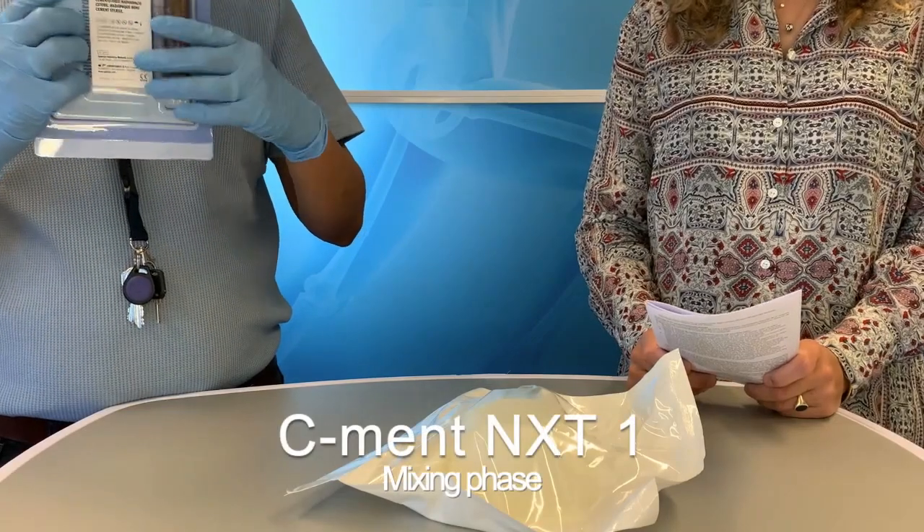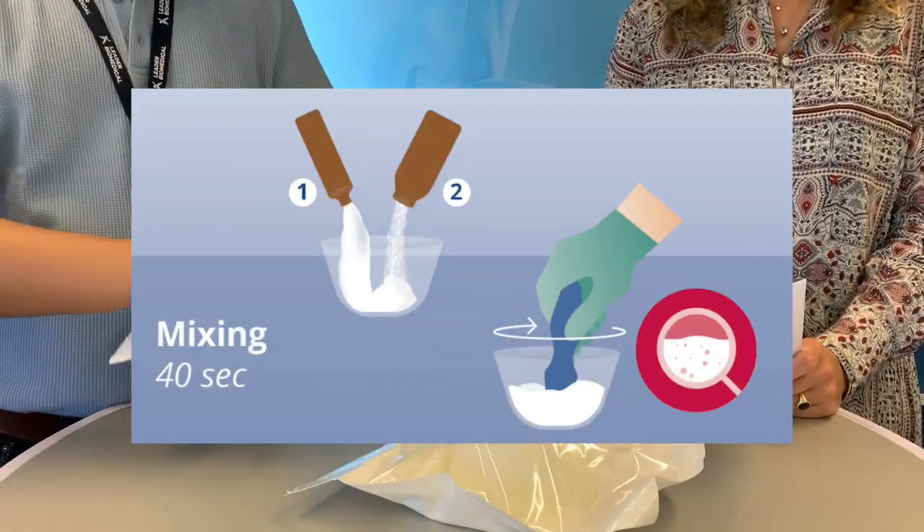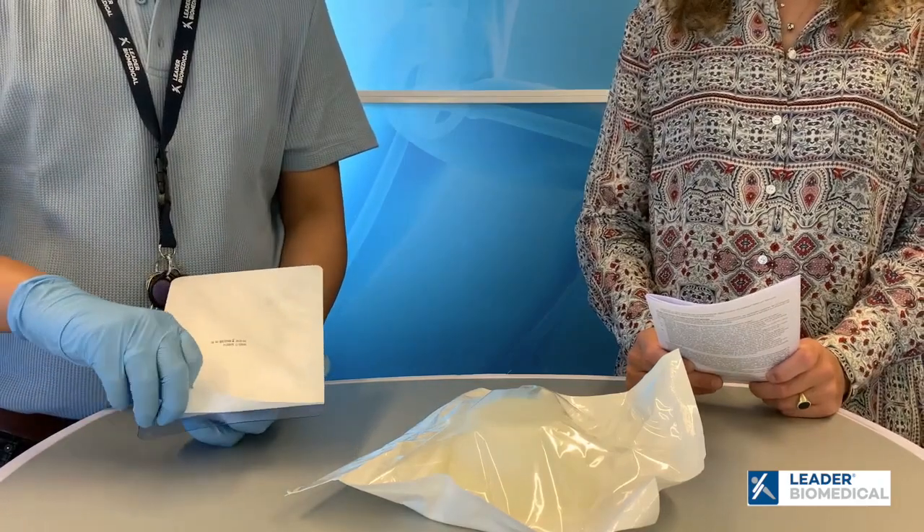In the package we have an ampoule with the liquid and the powder in a pouch. Rishi will now open the package.